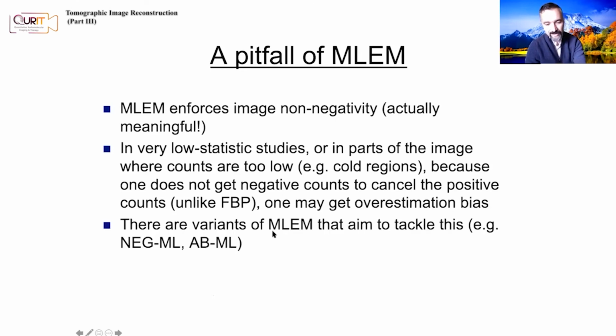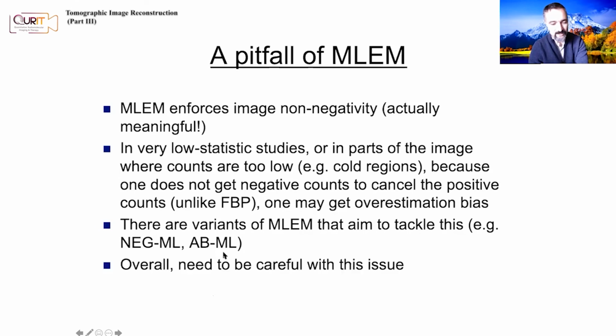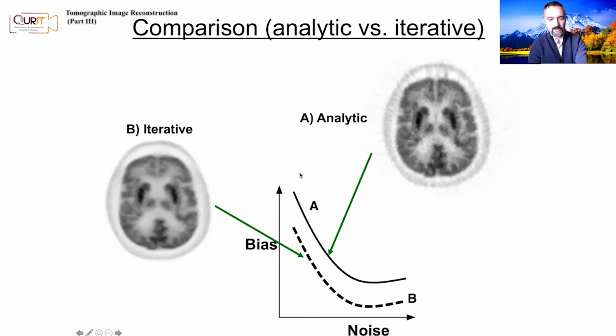Now, there are variants of MLEM that try to tackle this problem that I'm mentioning here. But at the end of the day, you need to be careful with this issue. You do need to have sufficient number of counts. If the number of counts become really low, you will have problems. So this is something to be careful about.